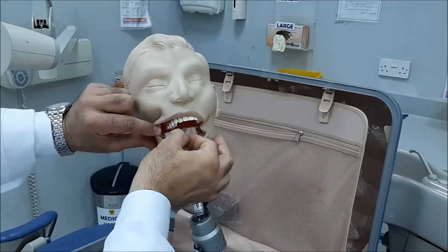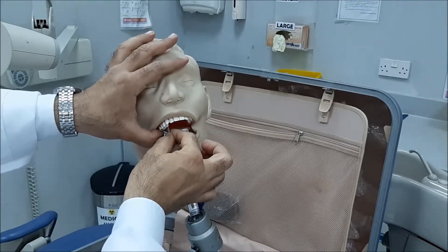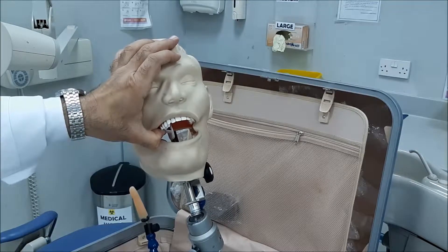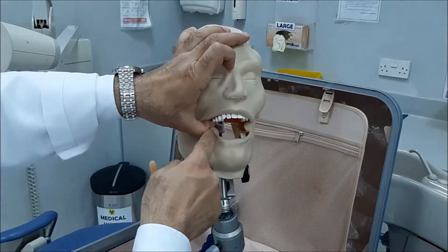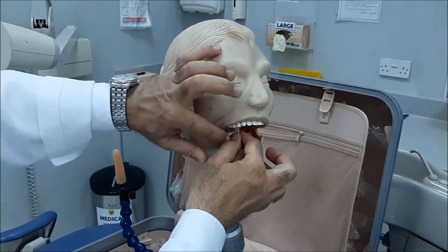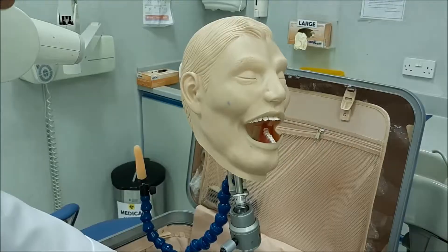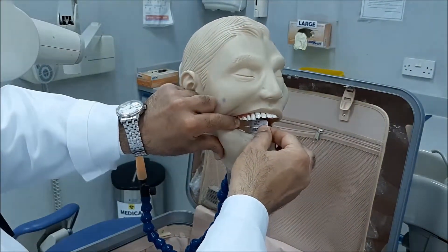Once I reach the second molar tooth, I will ask the patient to bite. I'll place the tab — this is the first molar — now the patient is biting on the second molar on the tab. So, second molar — this is the second molar.